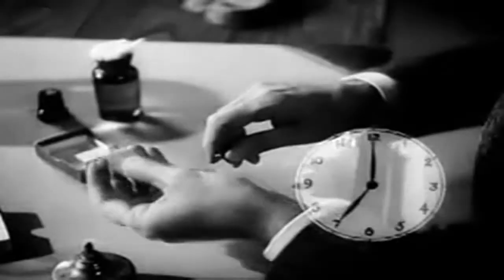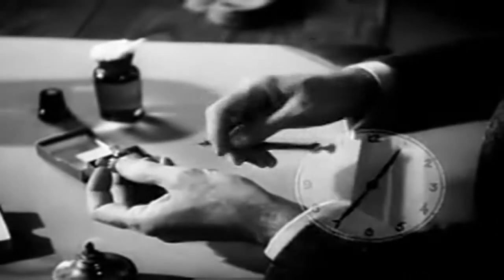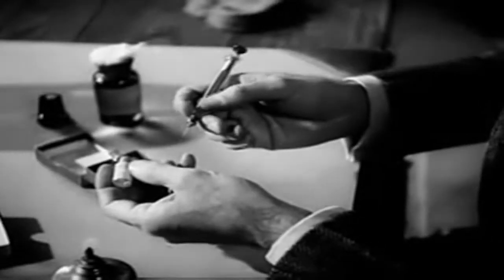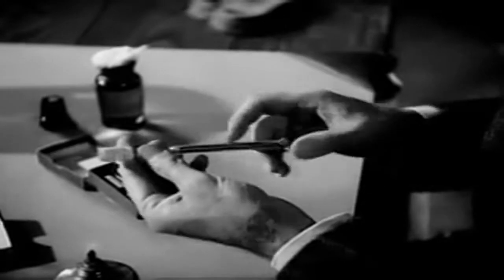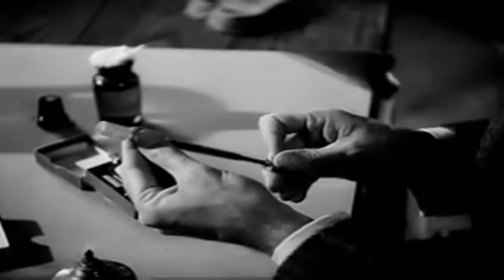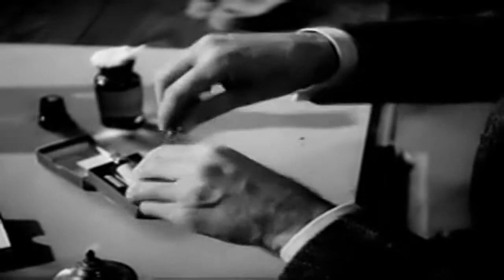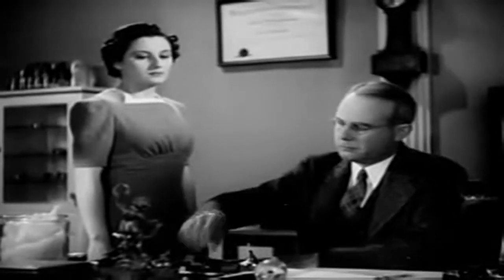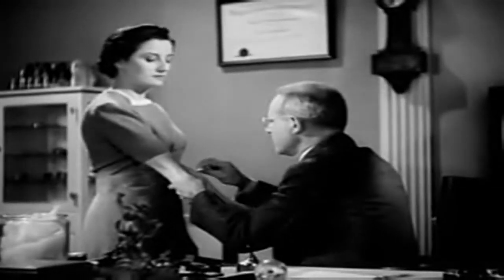Dissolve the tablet. Withdraw 1/10 of a cubic centimeter into the syringe. Cleanse the forearm with 95% alcohol.